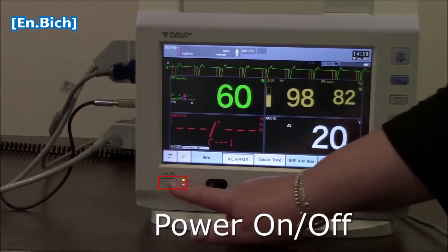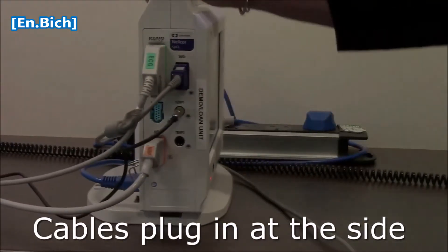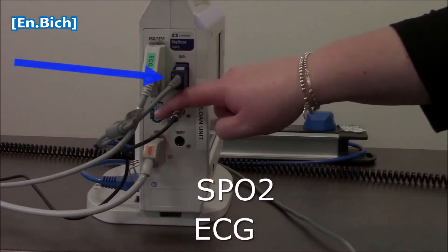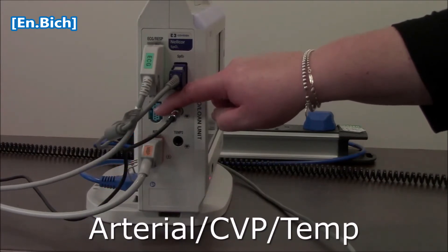The on/off button is here. We just turn the monitor around — you can see where those accessories plug in. So we've got our ECG, SATs, and this one could be for arterial pressure monitoring, CVP, or for temperature.